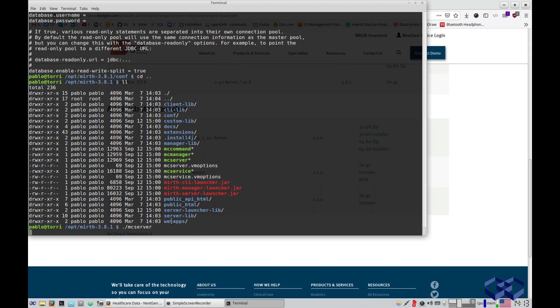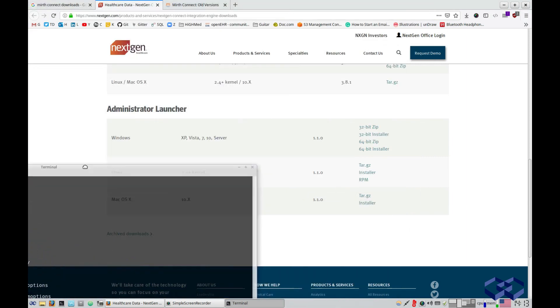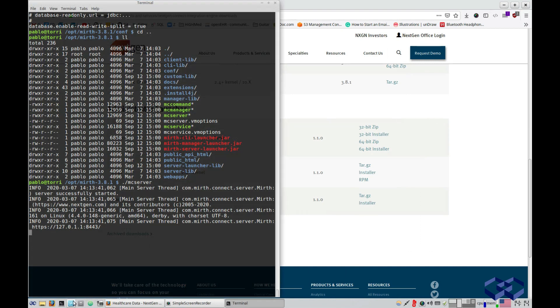If you just run MC server and everything is okay in the configuration — the ports are free — you will get a successful message that MIRTH Connect is running correctly. This might take a while. Once the server is running, you need to run the MIRTH Connect Administrator to do something useful with MIRTH. The MIRTH Connect Administrator is basically a user interface that allows you to interact with the server. Now it's running and everything seems okay.